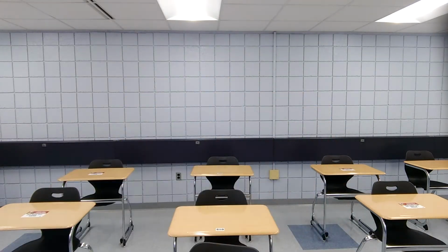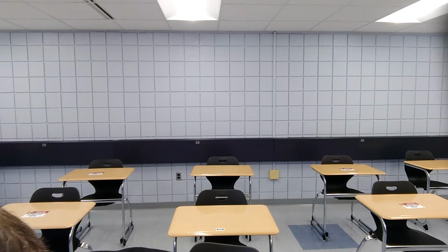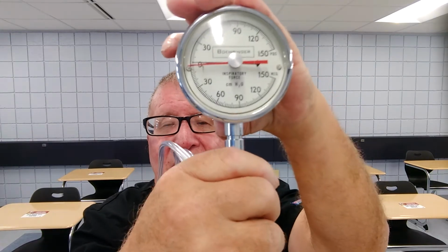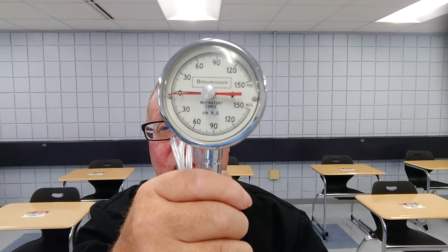Now, last but not least, this is an example of a NIF meter. Again, there are several of these on the market. This is the only one I could find, but this is what it looks like. And you see there's a little red needle on that, and there's also a black needle.